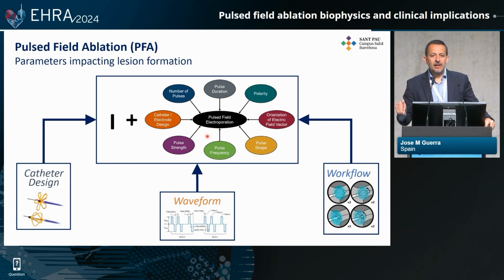And the third leg will be the workflow. Depending on how you apply, how many times you apply, how you move your catheter, the design of your catheter, the lesion you're going to be creating is going to be totally different. So this is the whole play.